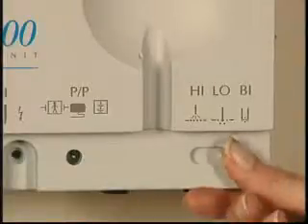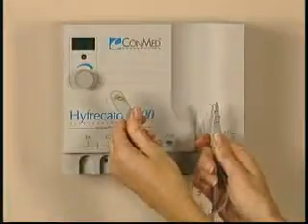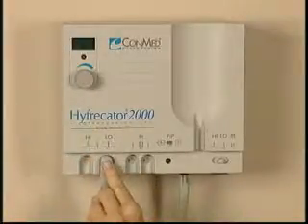Next, slide the power mode selector switch on the right side of the unit to designate the mode: low, high, or bipolar. There are two plugs on the pencil. The larger one is inserted into the bottom of the unit. The smaller one is connected to the power terminal corresponding to the mode designated.